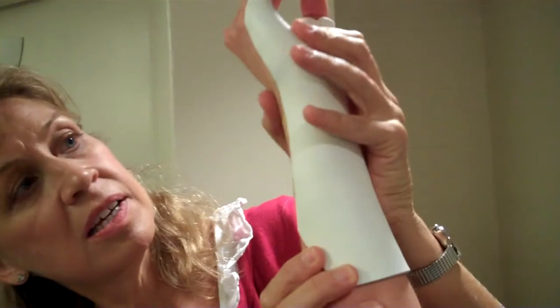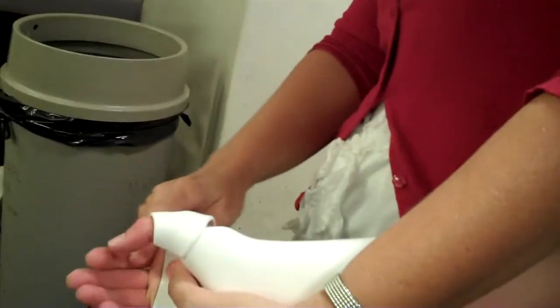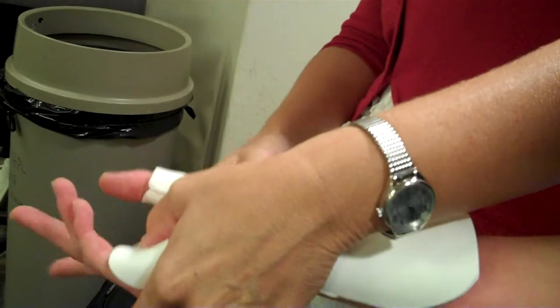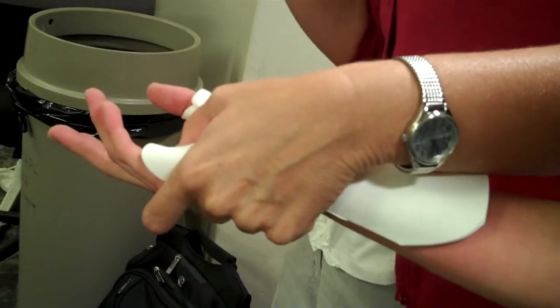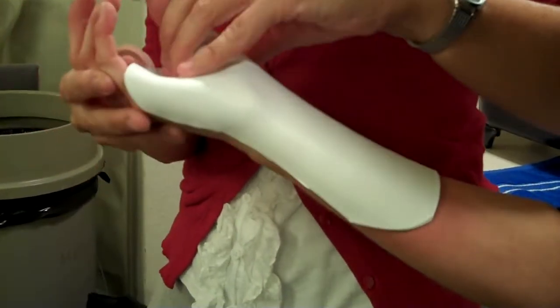What do we need? Is there any problem? We know it's too high here, right? Yeah. Okay. And what else? We know it's too high on the sides. It looks good on the other side. Okay. I don't know though. Look at this. I would say if she was a patient, she might come back and say, that's kind of bugging me right there. Like rubbing, maybe. So you might want to roll it or cut it. Okay. So let's go ahead. And the other thing is you got to make sure they can get it off.